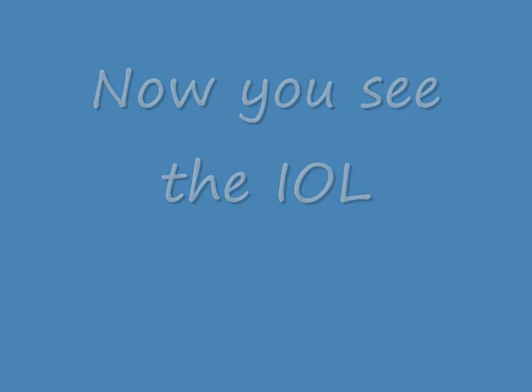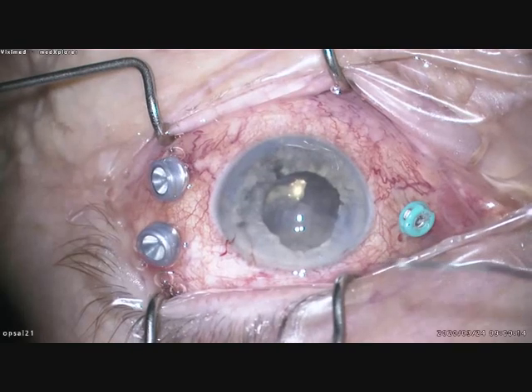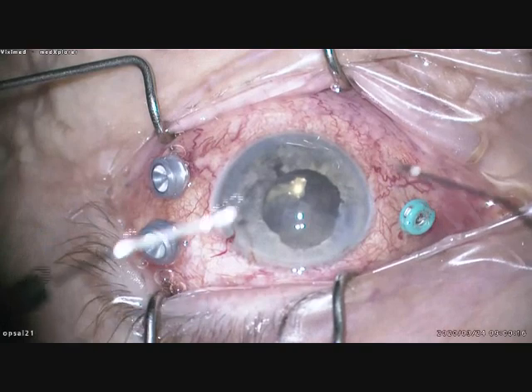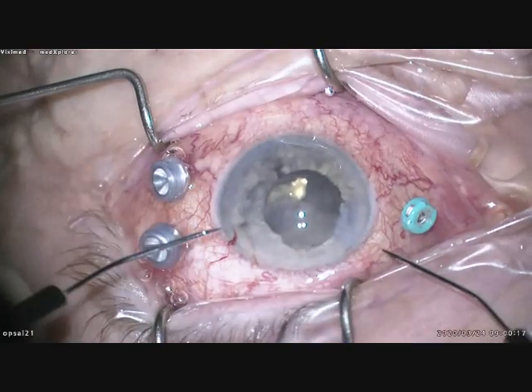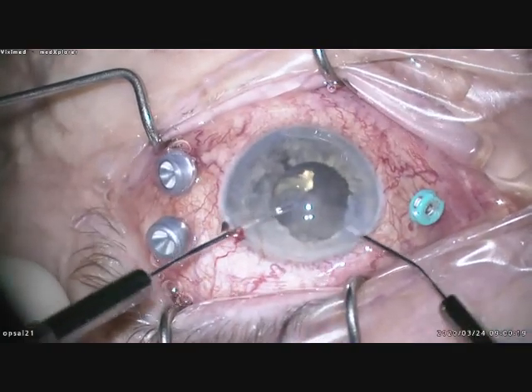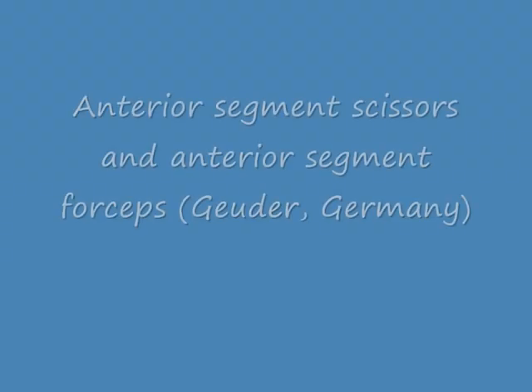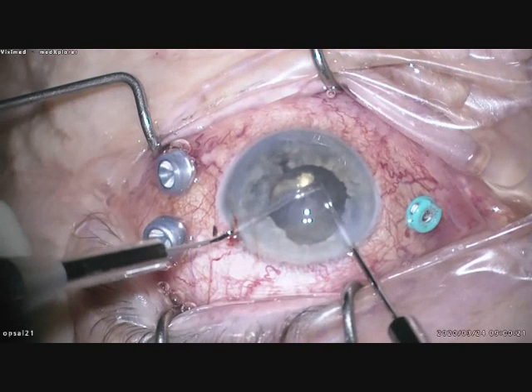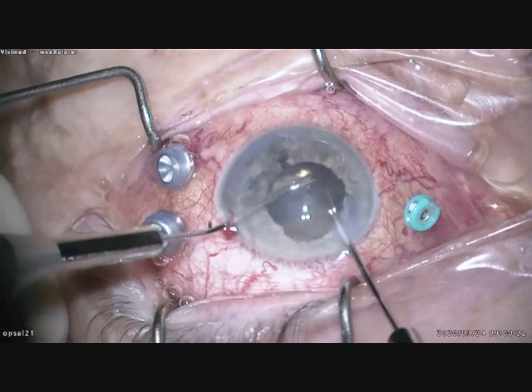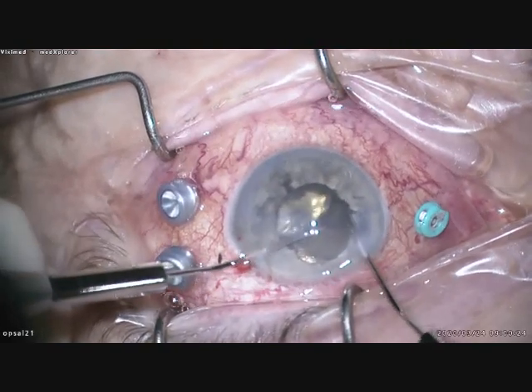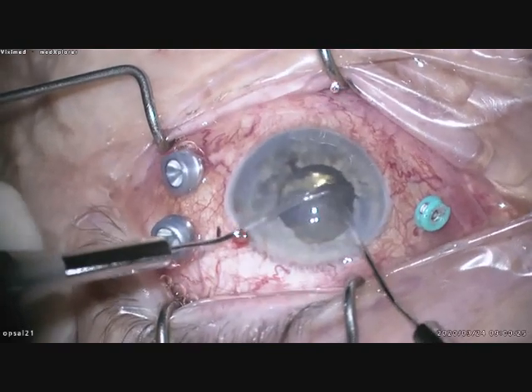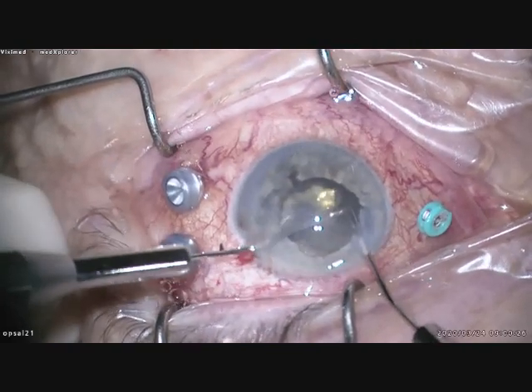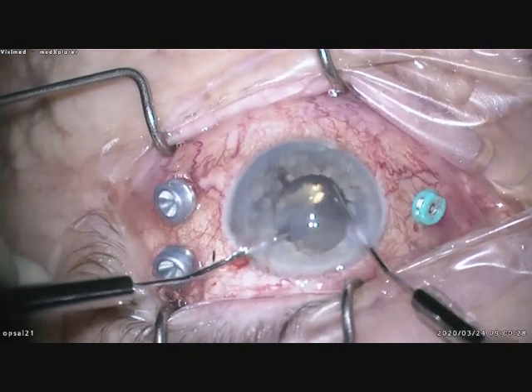Now you can also see the IOL. I'm using a Hattenbach iris forceps from Goida, Germany. With these two instruments the removal of the membrane is quite straightforward.